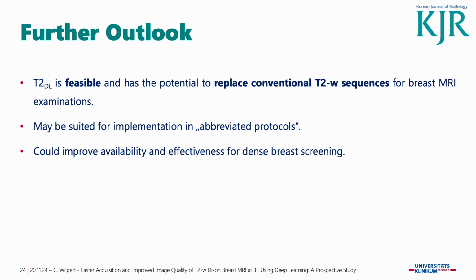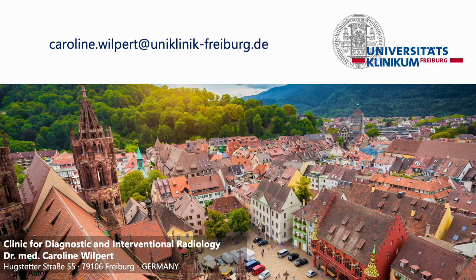And in summary, the deep learning sequence is feasible and has the potential to replace conventional T2-weighted sequences for breast MRI examinations. It might be suited for implementation in abbreviated protocols, and it could improve the availability and effectiveness for dense breast screening.